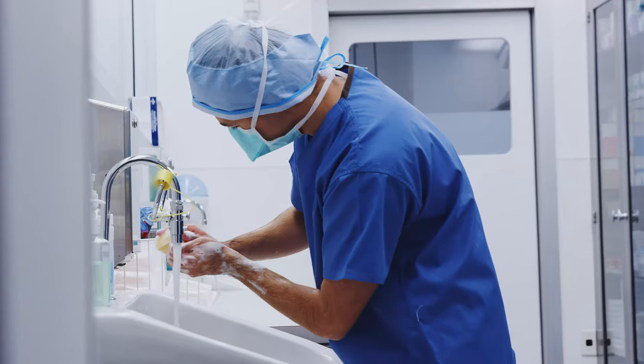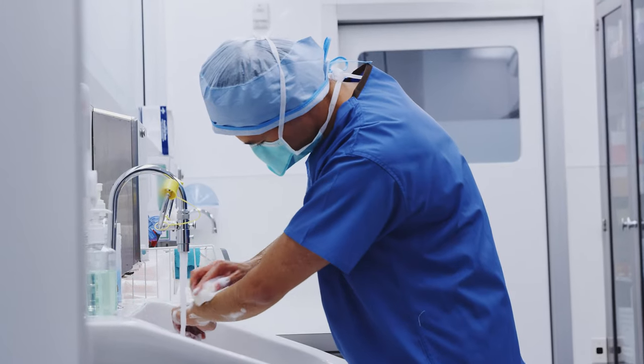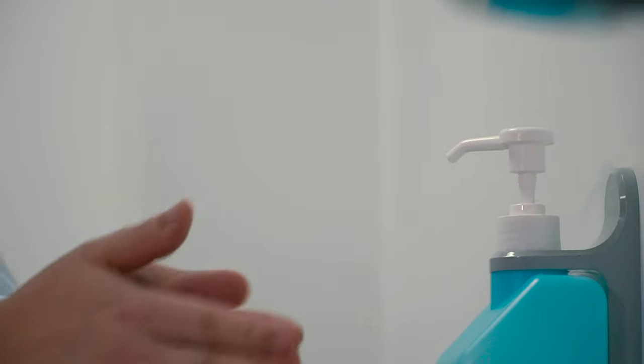Nonetheless, maintaining proper hygiene and infection control should always be paramount. If gloves seem to hamper the procedure, practitioners could consider disinfecting their hands thoroughly with an alcohol-based hand rub or other suitable antiseptic before starting. Remember, this isn't an ideal substitute for wearing gloves, especially in procedures with high infection risk, but it does serve as a potential alternative where gloves seem to impair the practitioner's ability to perform a procedure efficiently.